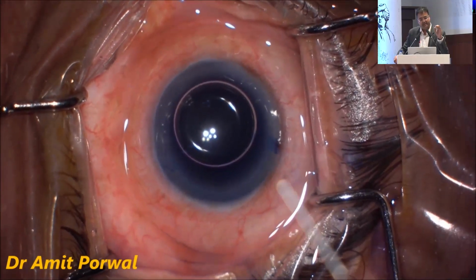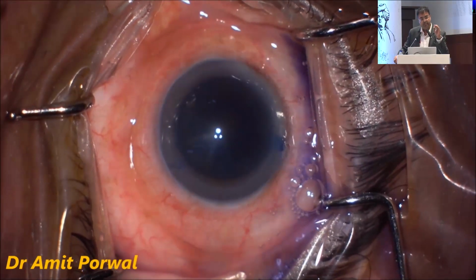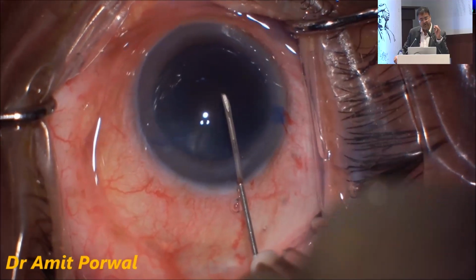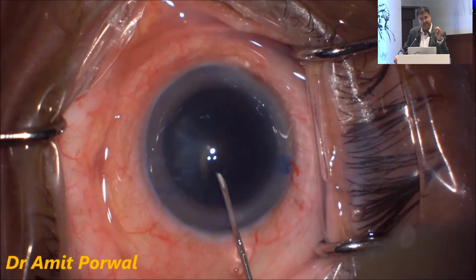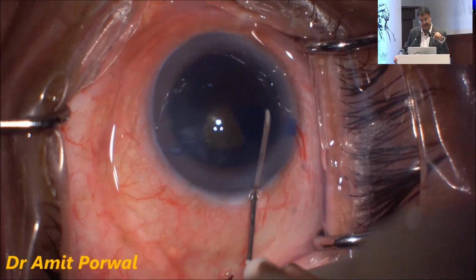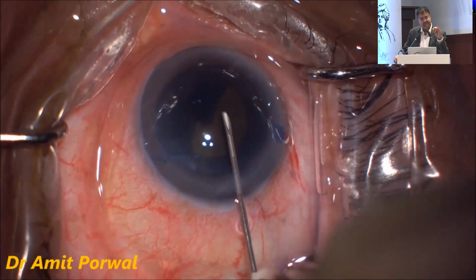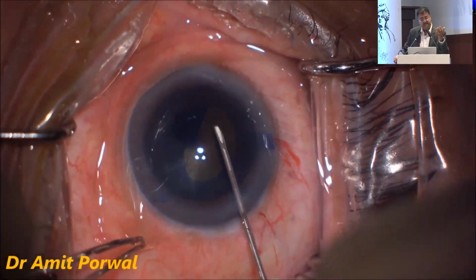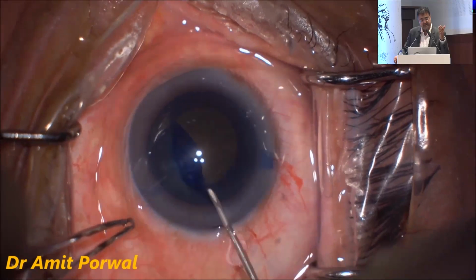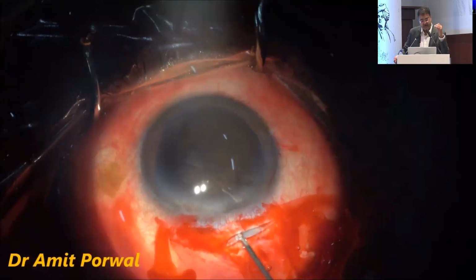So staining of the capsule is very, very important. I've been always stressing this, and staining should be done properly. Always take a tuberculin syringe, take about 0.2 to 0.3 ml of the dye and air in that, and then first inject the air and then the dye. You see how hard this cataract is. Because of the good staining, this capsule is stained and we can visualize it. If this capsule was not stained, visibility would have been very, very difficult.